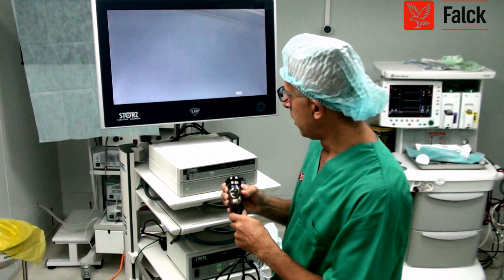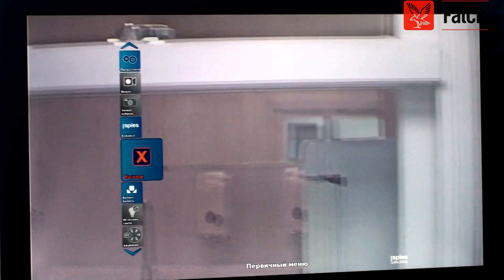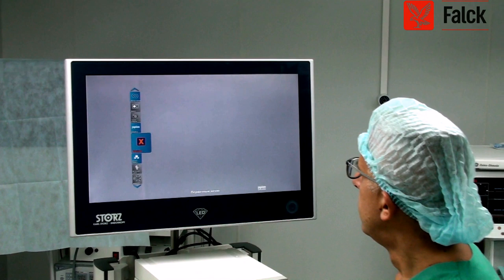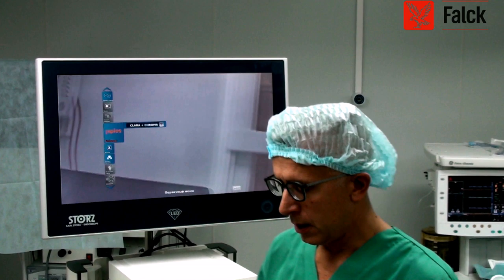If you see the monitor, you'll notice there is a menu here, and the menu is all in Cyrillic, but I can try to understand. This is the modality that you can select from this camera. And this is the Clara plus Chroma.